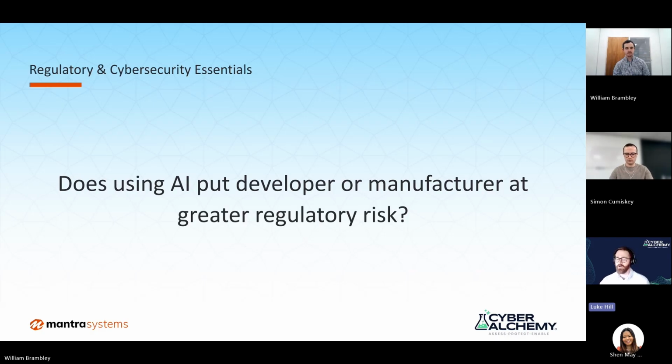Off the back of what Simon was just talking about there, if somebody was to add some data into your training set that wasn't supposed to be there because they were feeling malicious, and that affected the accuracy of your classifier, that could be a huge problem.